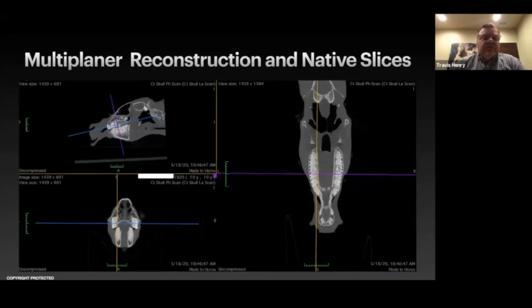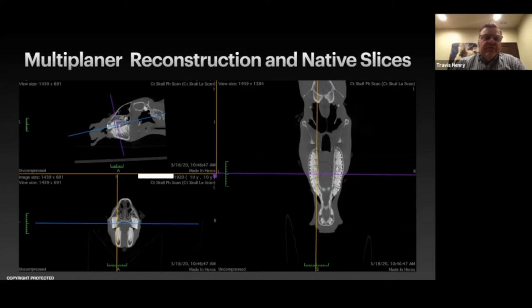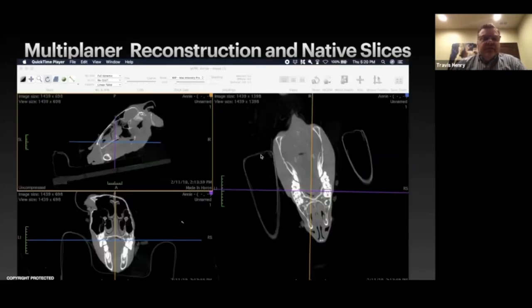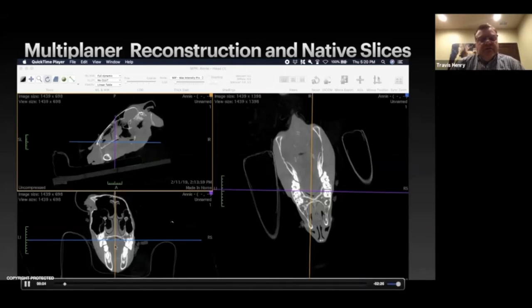Here I've corrected for the positioning — you can see we're now cutting through the sagittal right through the dental quadrants. We can also adjust to see all of the teeth at once. The dorsal view is lined up parallel to the palate, and we're perpendicular to the palate so we can look at individual teeth without getting part of one tooth and part of another in the same transverse slice. This video shows that correction happening.